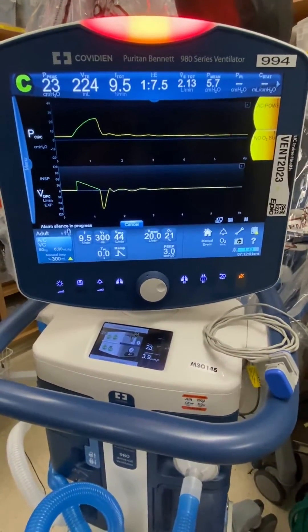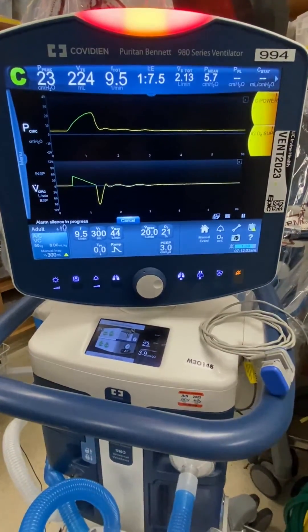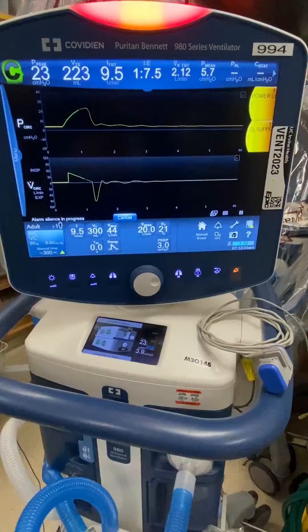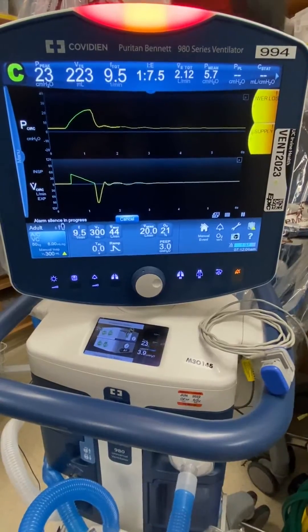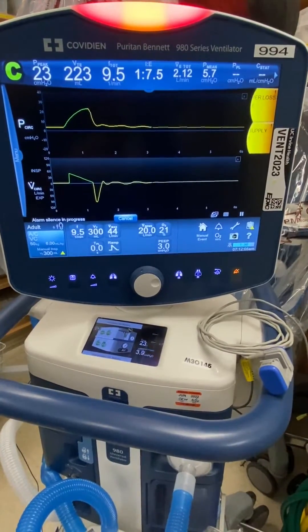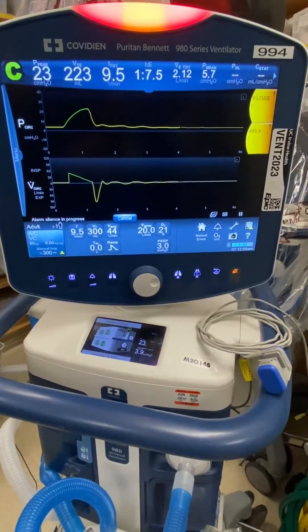Hey guys, welcome back to the MinuteClinic. I've gotten a few questions on how to properly set up your end tidal capnography on the 980.